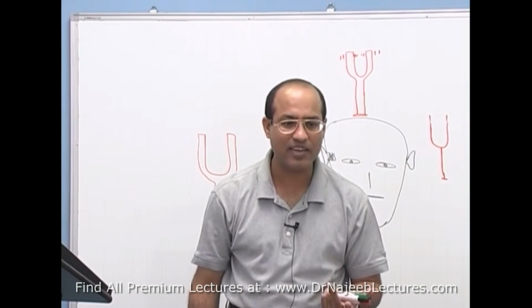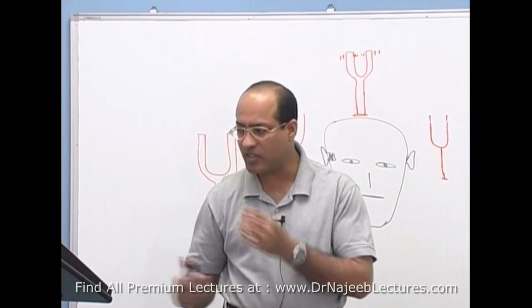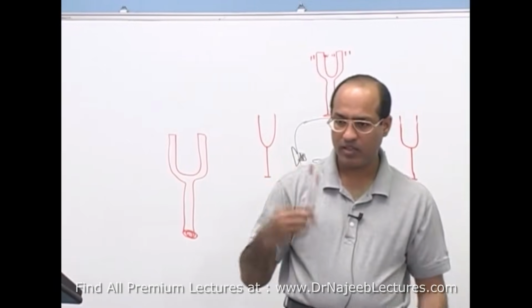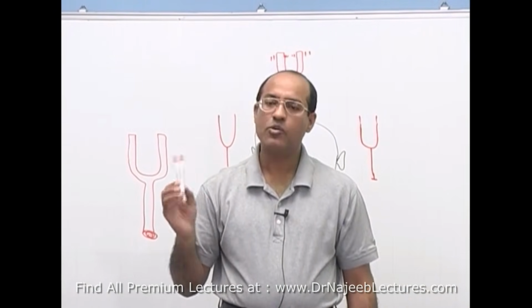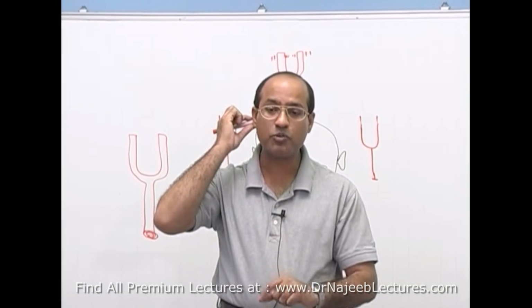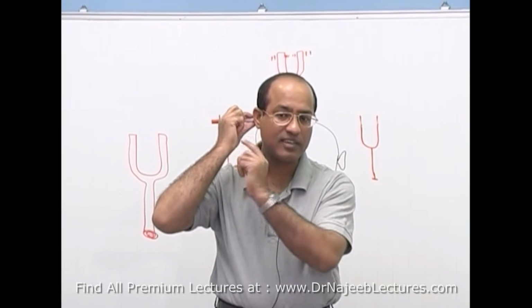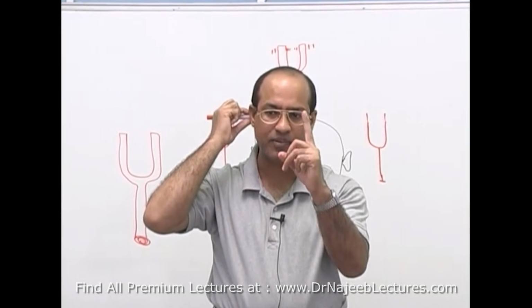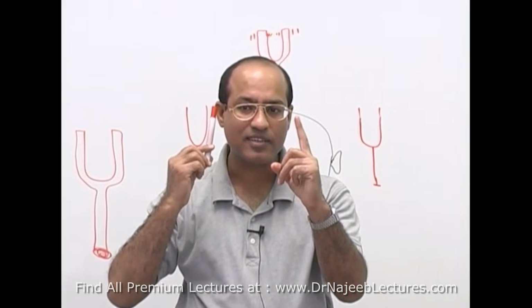How will you confirm that? The test is Rinne's test. In Rinne's test, you take the tuning fork and get it vibrating. First you put it on the patient's mastoid and ask the patient to give a signal when he stops hearing. For example, as soon as the vibration becomes less and I stop hearing it, I raise my finger. You immediately remove it from here and bring the prongs near my ear.